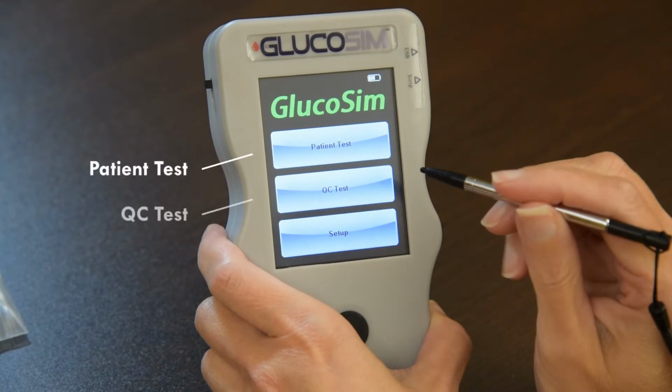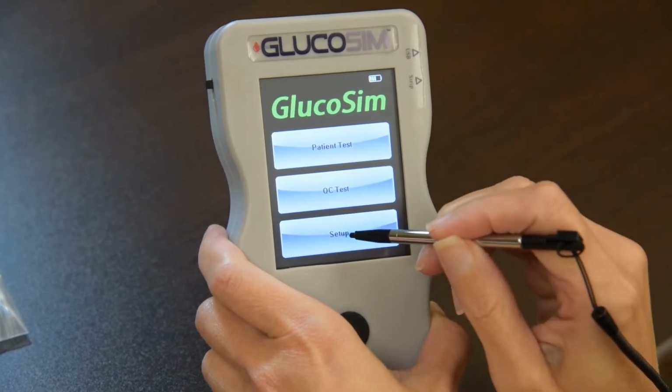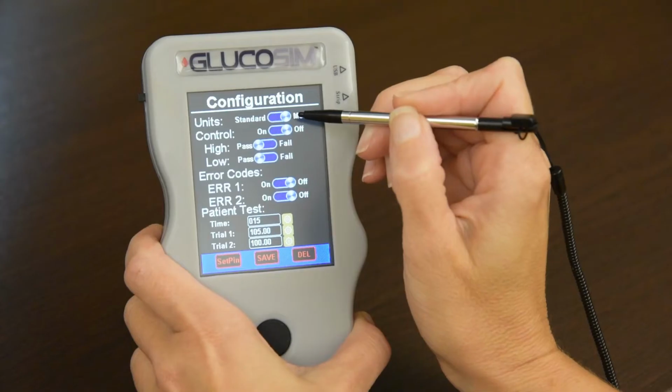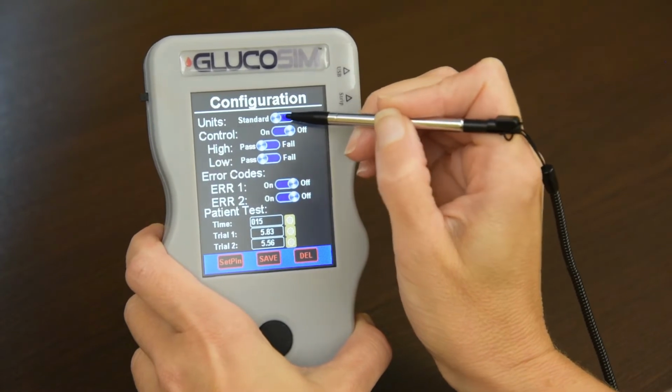The home screen shows 3 buttons: Patient Test, QC Test, and Setup. Select Setup. Enter the default PIN 999 and press OK. You can change the PIN by choosing Set PIN at the bottom of the configuration screen.